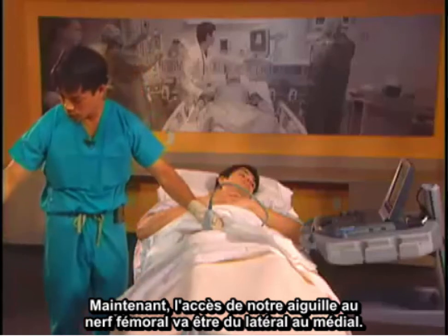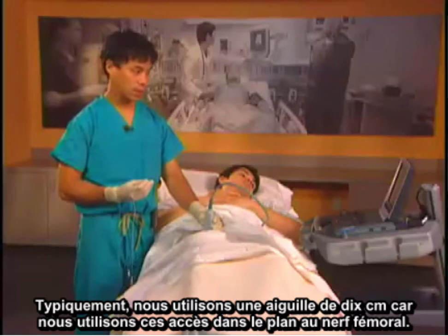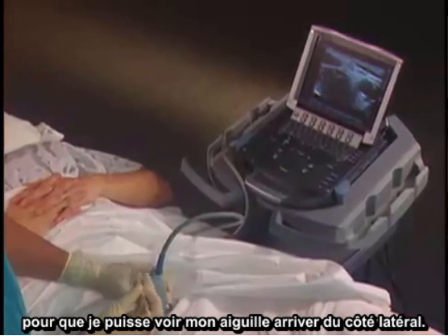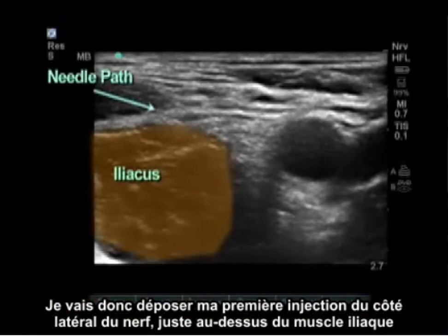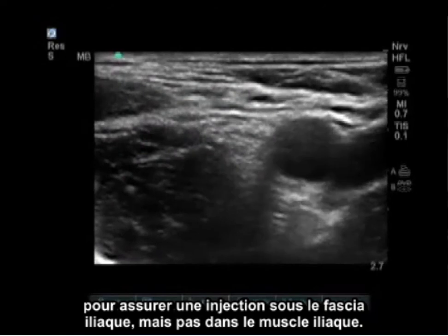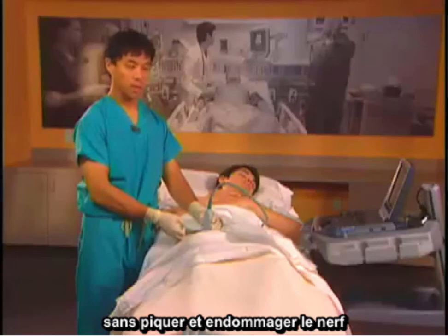Our needle approach to the femoral nerve is going to be from lateral to medial. Typically we use a 10 centimeter needle because we use an in-plane approach to the femoral nerve. I like to put my target on the further side of the screen so I can see my needle coming in from the lateral side. I'll put my first injection lateral to the nerve, just above the iliacus muscle, to ensure injection below the fascia iliaca but not within the iliacus muscle. By using typical volumes such as 20 to 30 milliliters, we'll get spread above or below the nerve without poking into and damaging it.